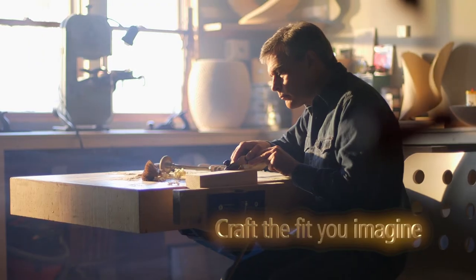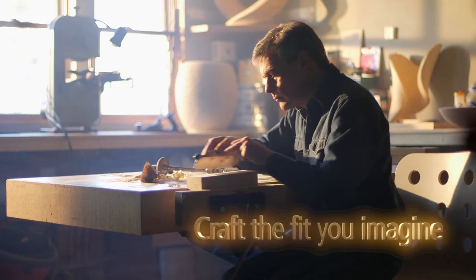Craft the fit you imagine. Designed by you. 3D milled for your patient.